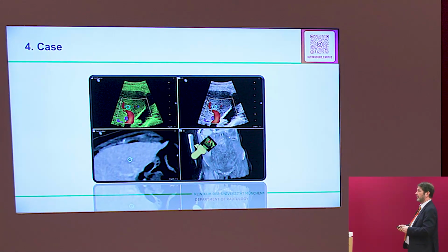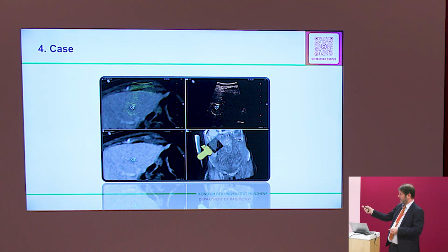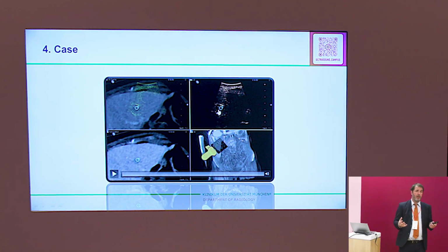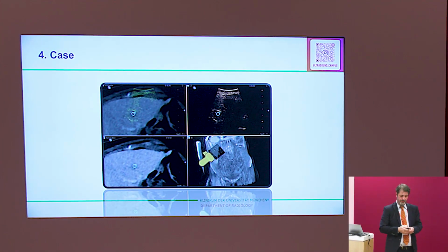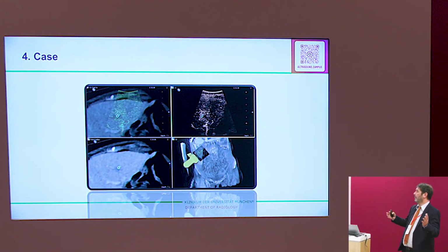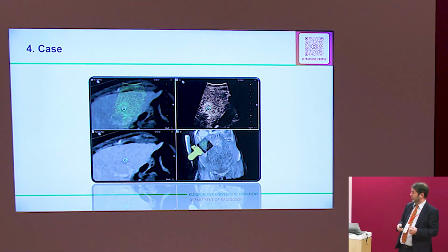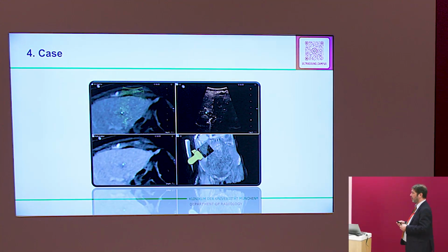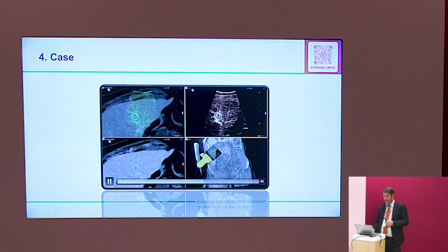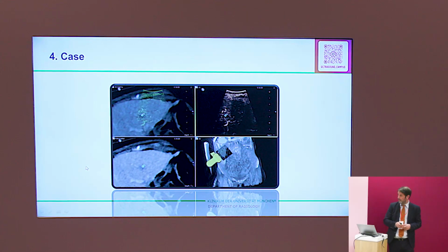In the next step, we have to think about what kind of lesion it might be. So we see our blue circle there. This is the area of interest because we have to see how this lesion behaves. Okay, we see a moderate uptake, a little stronger in comparison to the surrounding tissue. But you also see already at the end of this clip that this lesion gets darker in the middle. Do you see this there?